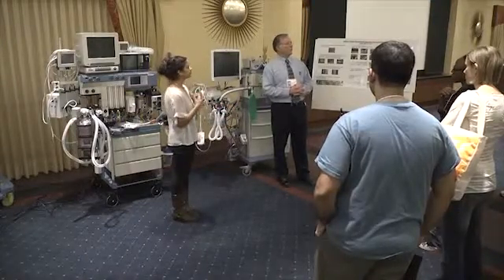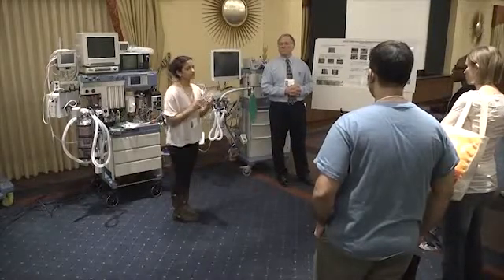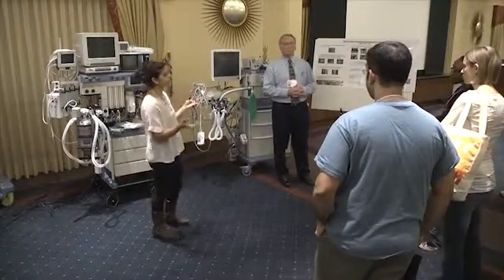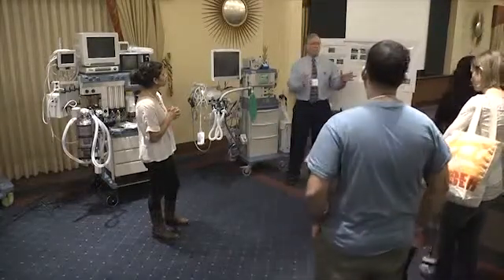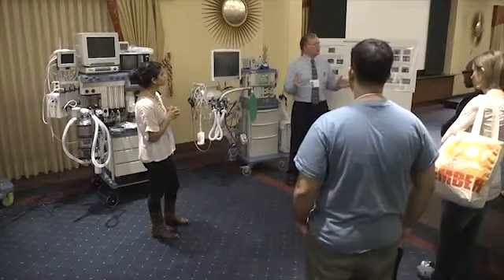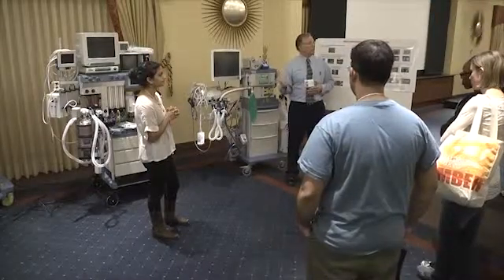Exactly. 1,000 I think is just a magic number we came up with because 330, or we can round it to 300 liters, will get you a good amount of time. If you're running 5 liters of flow, it gets you an hour. I think that's common knowledge you could use. To a lot of people, 1,000 PSI is just a number they know, but it doesn't really apply practically. You need to know that you have an hour at 5 liters. That's really what you're looking for on your machine.